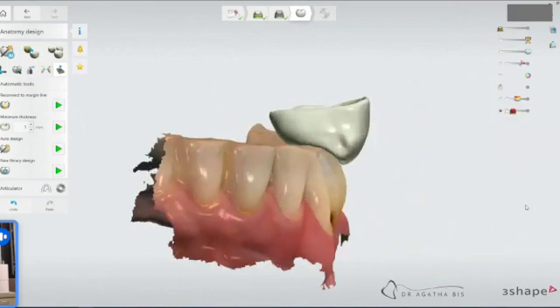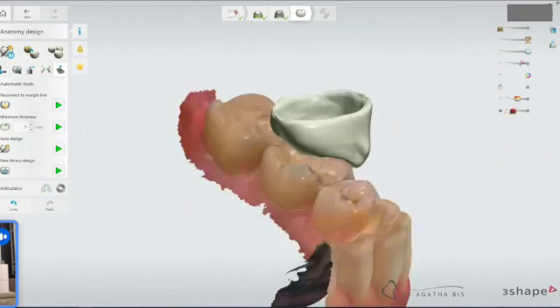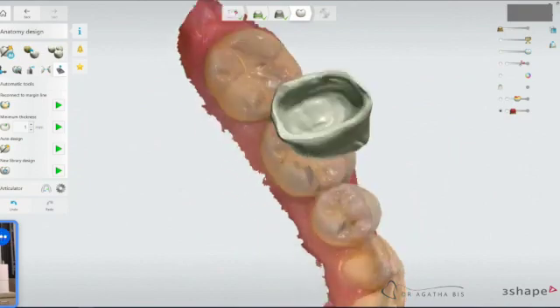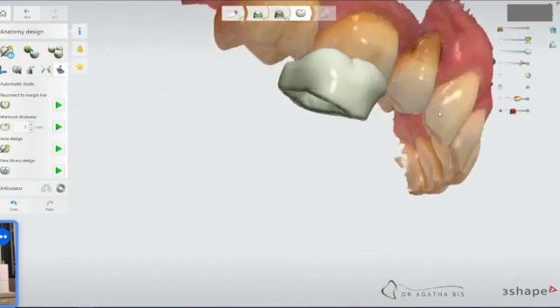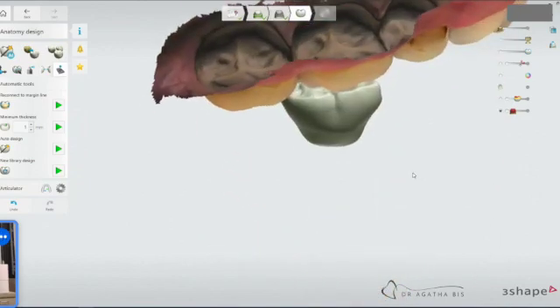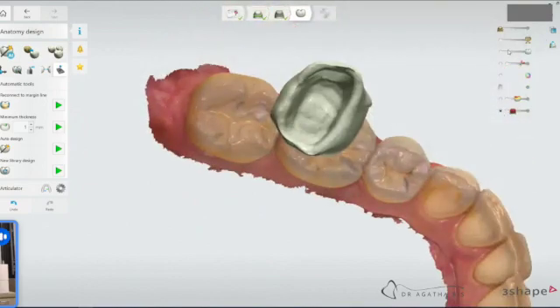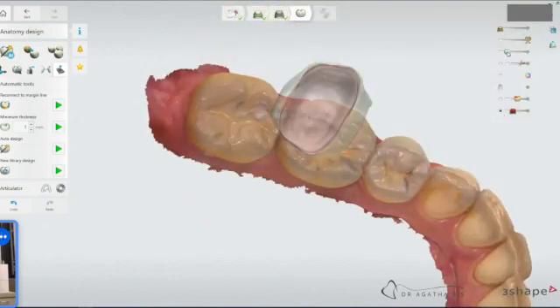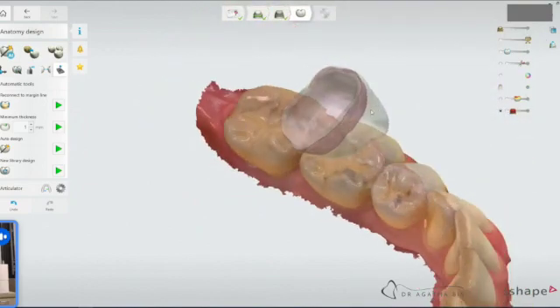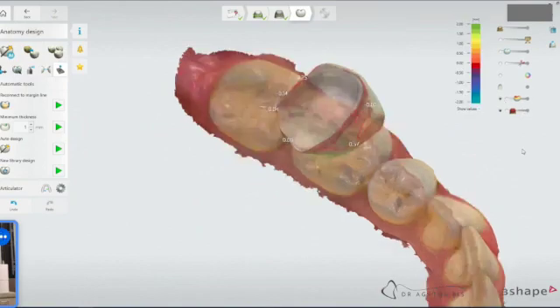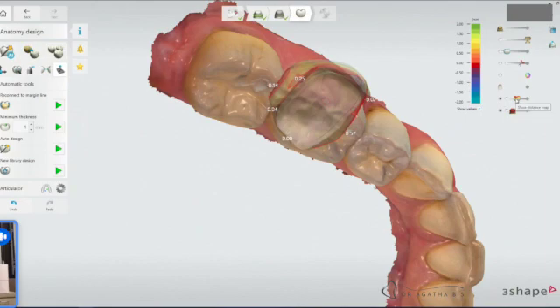Then I want to see where is the cusp or where should it be? Where should the lower cusp be in this situation? It should be right in that fossa. If I thin out my crown right here, I can see where that contact is. And it's right there. I just clicked right here to show the distance map. And then I get to see that there's a contact right there. Now I actually like to work with stone models.